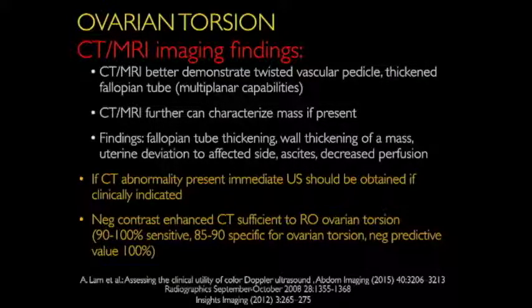Also, it's important to know that if there is an abnormality present on the CT, which is done in the ED, and you don't find any other causes for the pain, perhaps it's really helpful to get an immediate ultrasound. However, if the adnexa looks completely normal on the CT, and symmetric, no funny business, basically, you can say you don't need to get an ultrasound to confirm it.